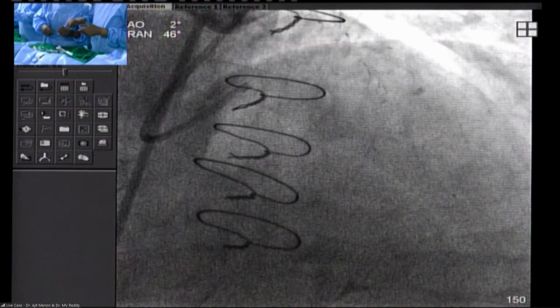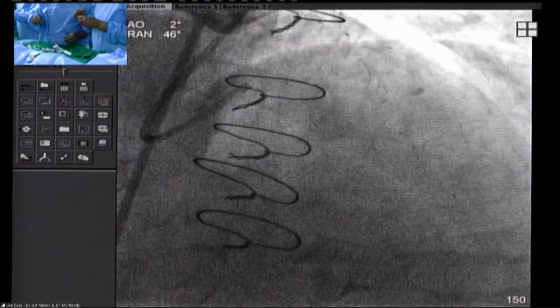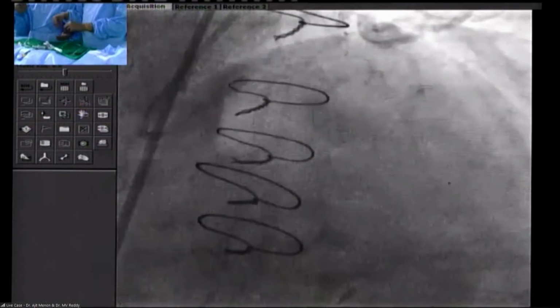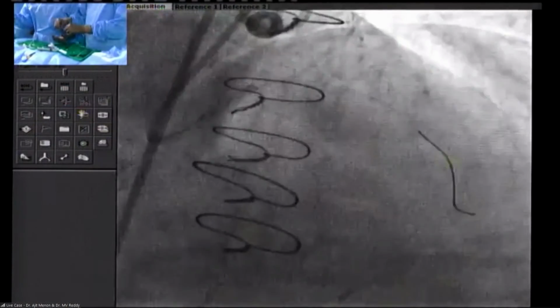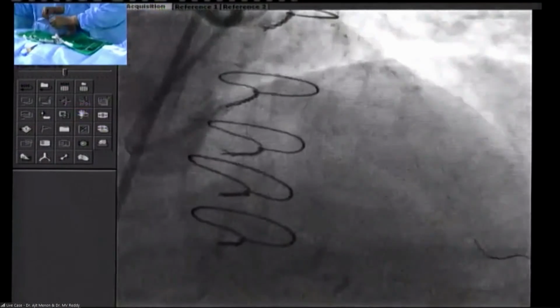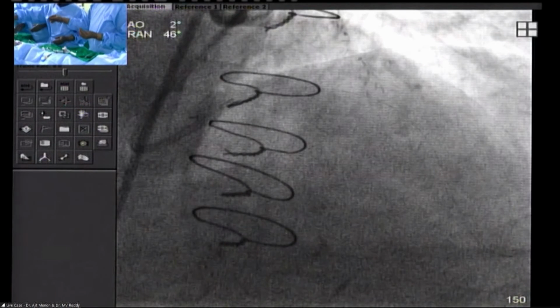I still cannot figure out where the air went in from, because we had not cannulated the coronary at all. You want Nicoran, sir? This is Nicoran. Trapper, 2 mm balloon. It doesn't necessarily have to be air. It could be spasm, it could be a variety of things, but air seems most likely, and it can come from anywhere. 2.5 balloon. Give me the indiflator, please.